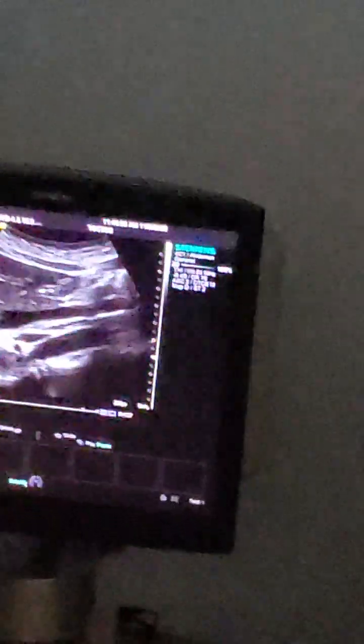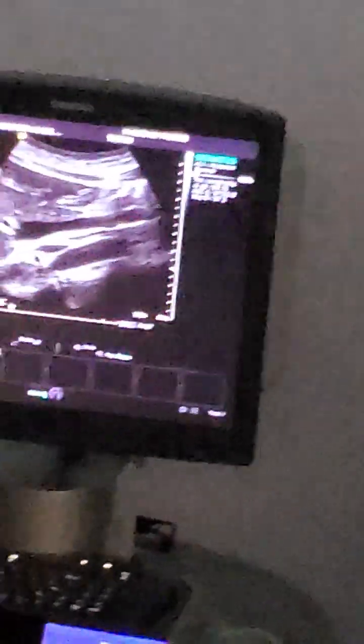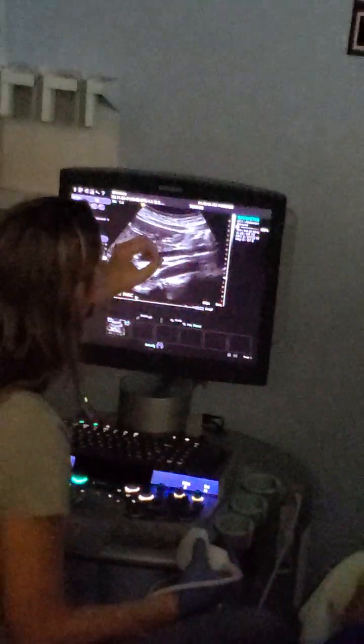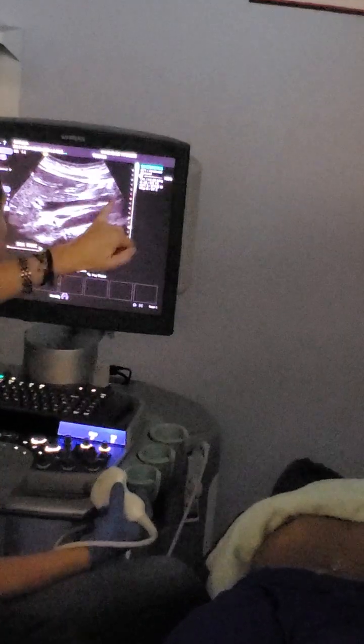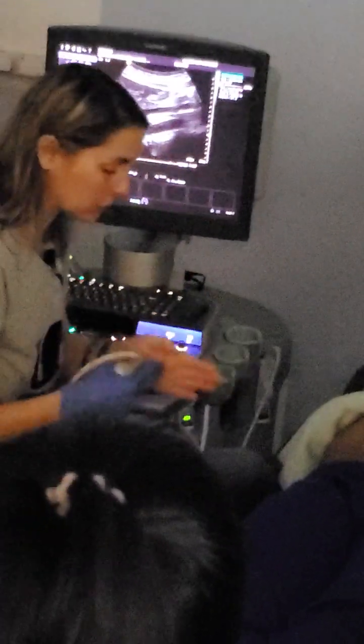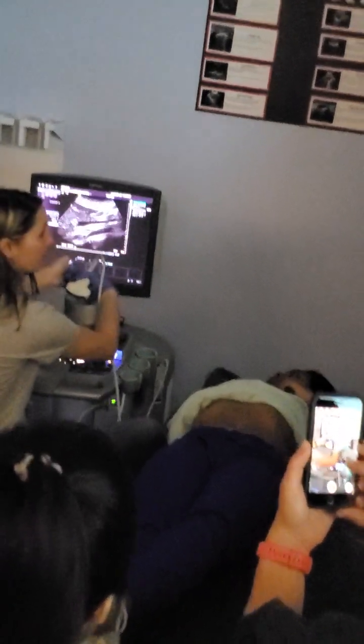So her left is over here, her right is over here. Spleen over there, liver over here. Portal splenic confluence in cross section, with SMV and IMV plugging into it. So it's like a big T. Before, we looked at the top of the T, and now we're looking at the side of the T.